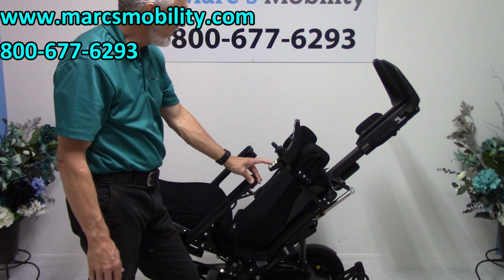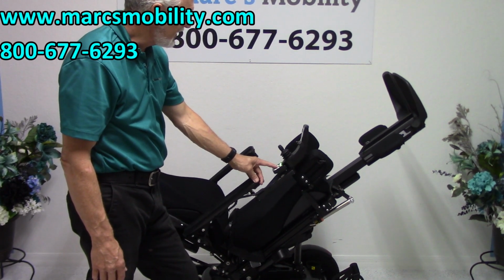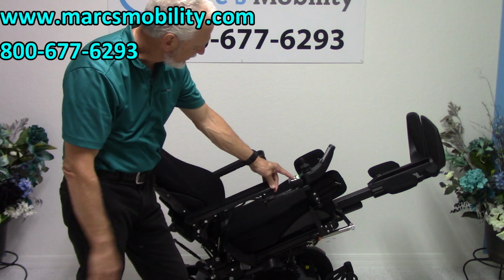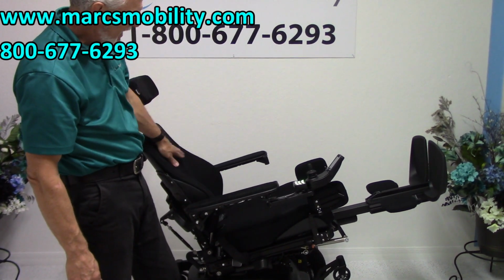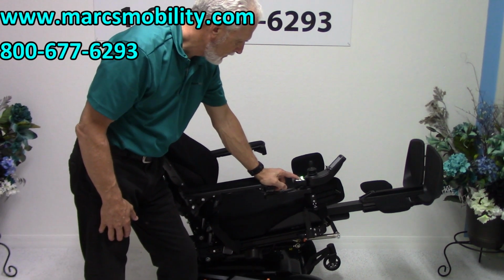Okay? If you need it to be less tilted, you could bring the seat halfway down, and your legs would still be higher than your body. So if you drop the seat to about here, your legs would still be higher than your body. The tilt back down.